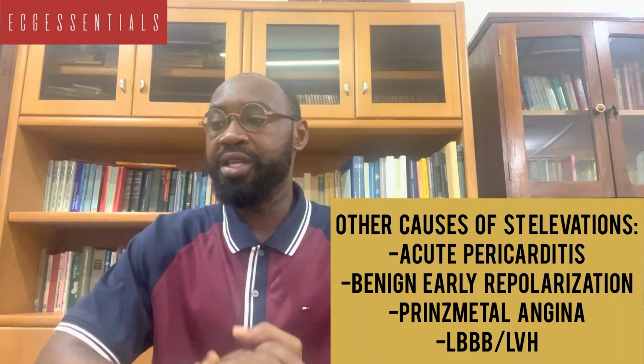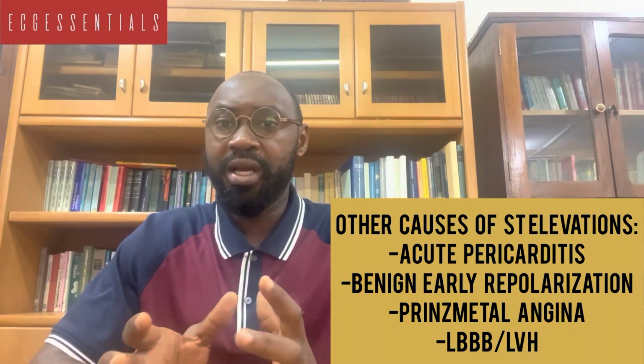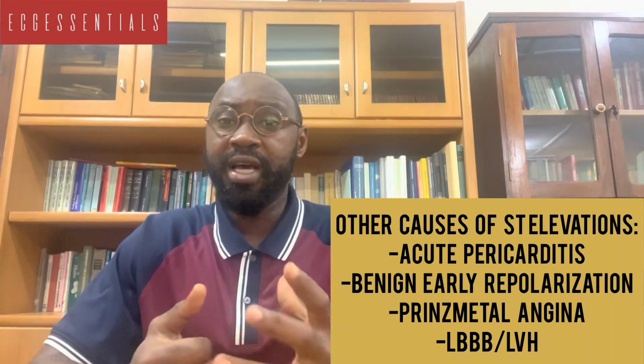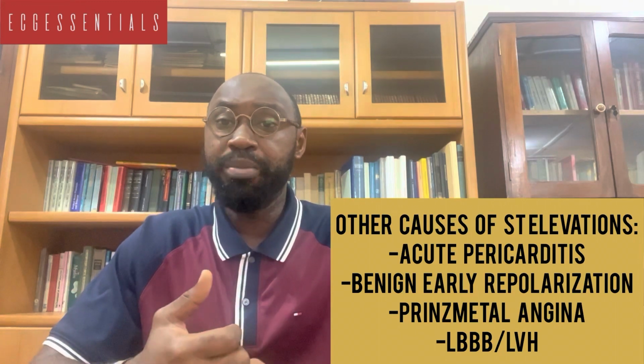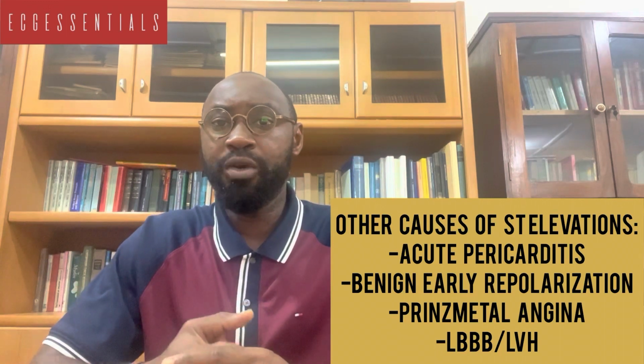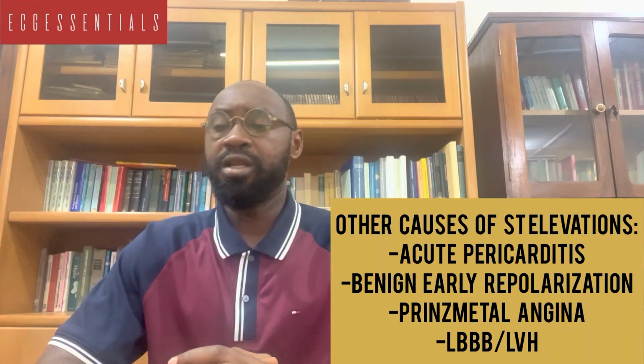So for ST segment elevations, apart from myocardial infarction, some of the other causes that we should keep in mind whilst we are reading our ECG could be Prinzmetal angina, that is vasospastic angina. It could also be caused by pericarditis, as we have just explained. Benign early repolarization has also been mentioned. Sometimes in left bundle branch blocks and left ventricular hypertrophy, we can have ST elevations as well.